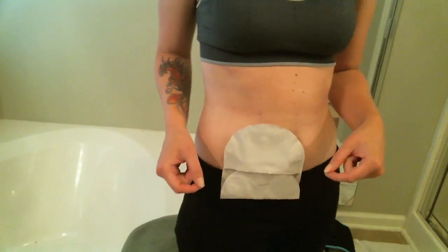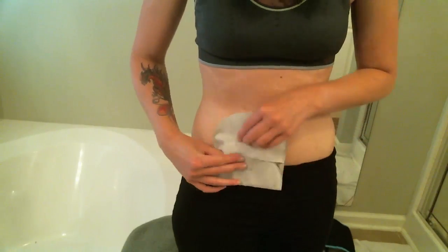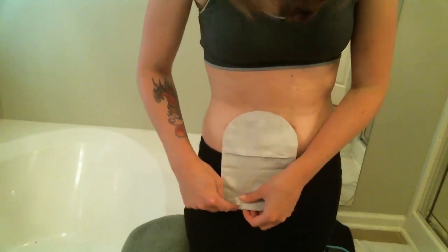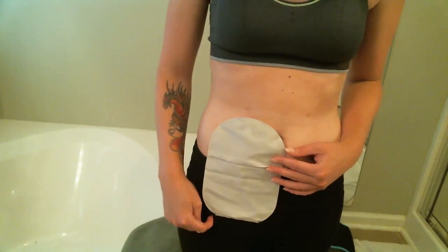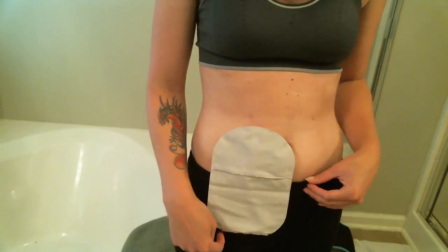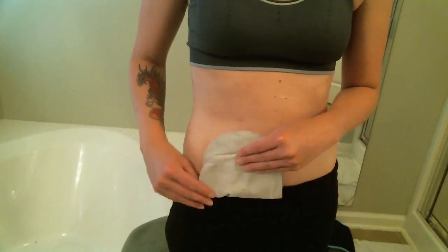I found this to be a really great option this morning when I went for my run, because I have had issues in the past where even with it folded up, when I'm running, this corner right here would dig into my leg, and I've actually gotten fairly substantial scratches on my leg that would hurt. And so being able to hold it up like that was a great way to do it.